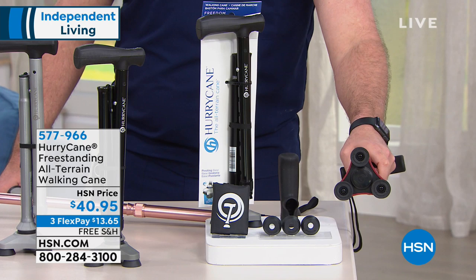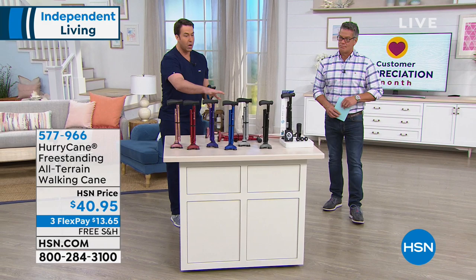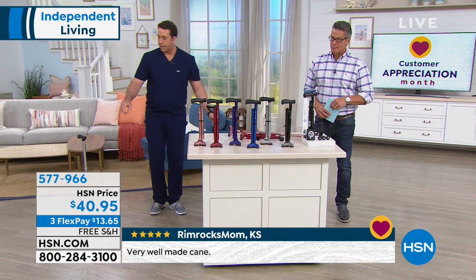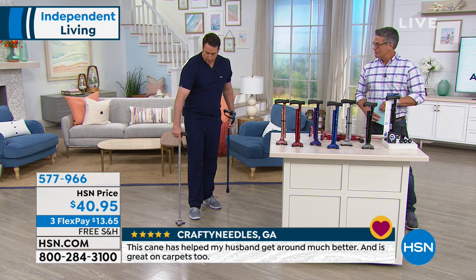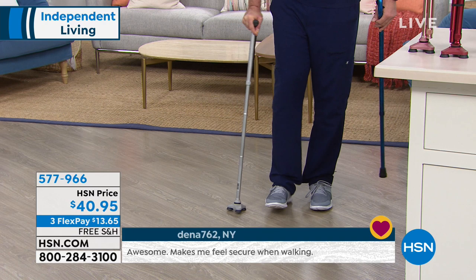So when we talk about a freestanding cane — and by the way, these are brand new colors, rose gold is brand new — here is my HurryCane right here. I'm 6'3" and it's the perfect size for me. It has eight height adjustments, so it's going to be perfect for you as well, and those are right on the side here. Here's my heavenly handle, and as you can see, three points of stability, which is going to mimic my foot and ankle as I walk.